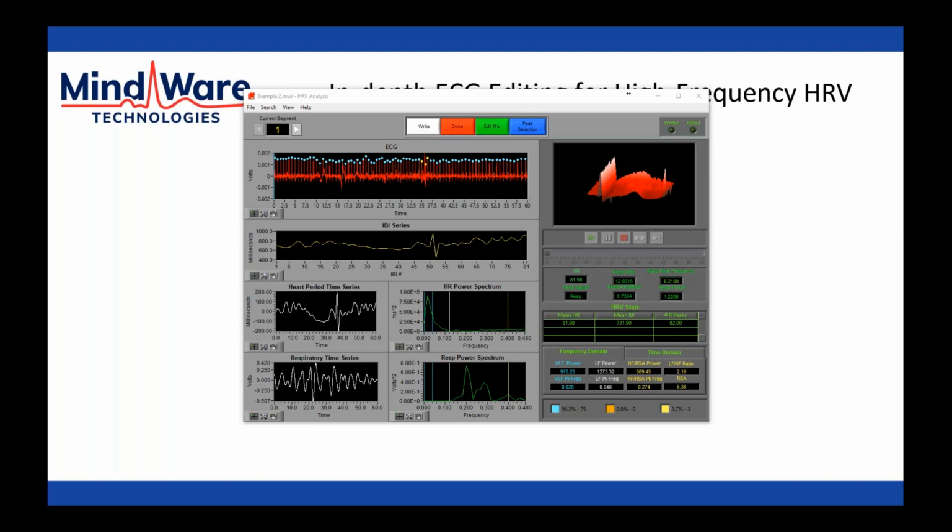Okay, this is a fun question. Is it possible to get correct ECG readings on males with chest hair? This is a real problem. Probably not possible for us to get IRB approval to shave. Your guidelines on this. Because of the location of the ECG electrodes in particular, being on the right clavicle and the lower left rib, those are not generally areas where there's a lot of body hair present. So ECG is actually the easier one to get.